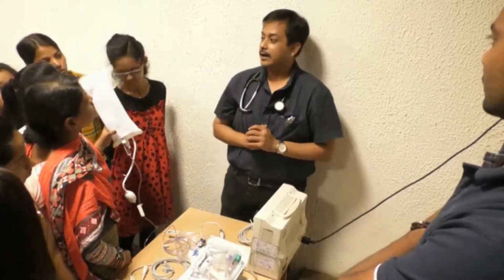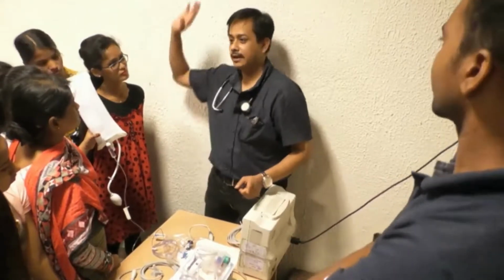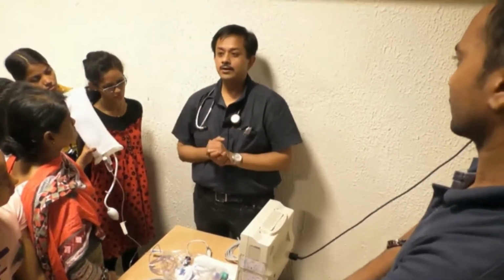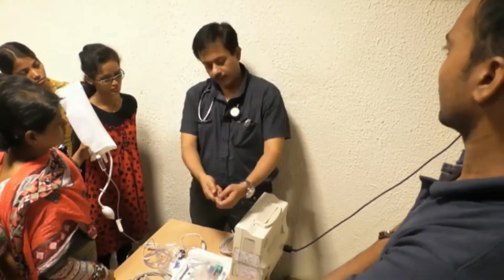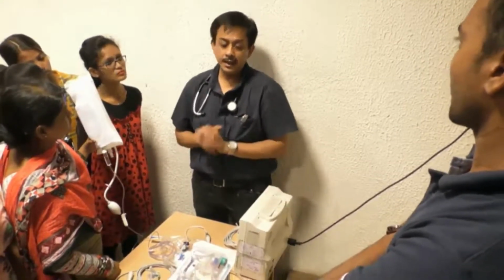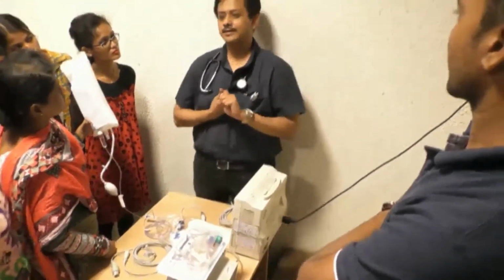Yes. Now I have to know whether there is anything wrong with my setup, the arterial catheter and the transducer and my entire setup. So for that, what can I do? First, you ensure that there is free flow in the arterial line. You can also aspirate to see whether there is free flow. Then I have to know whether there is something wrong with the system. For that, there is a test of accuracy. I have shown it.